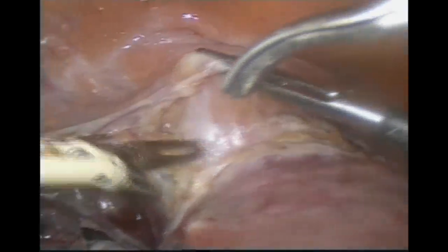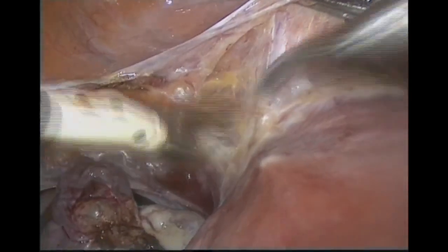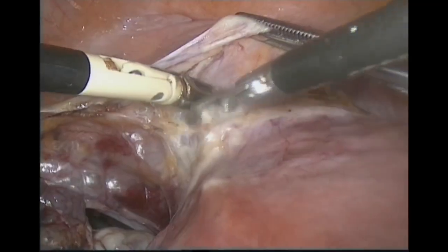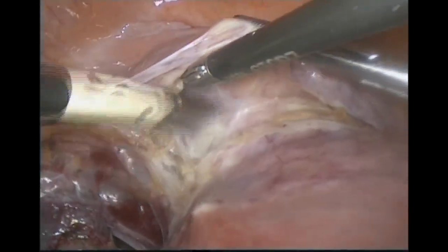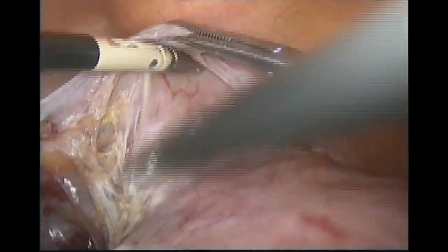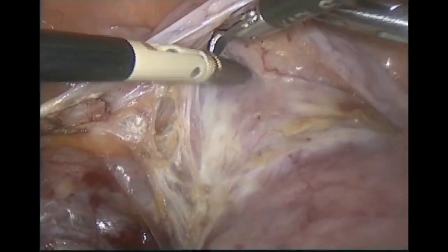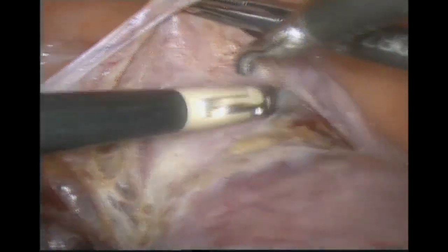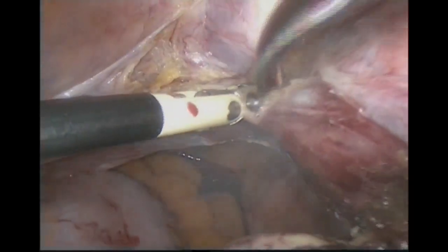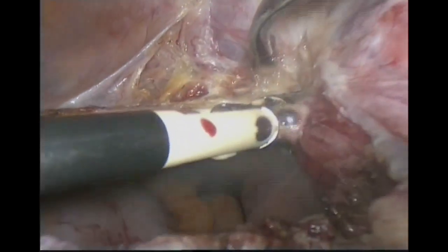Then you need to dissect the bladder fold and mobilize the bladder below the colpotomizer or colpotomy cup. Stay in an avascular plane. Keep the dissection on the cervix and the vaginal wall.